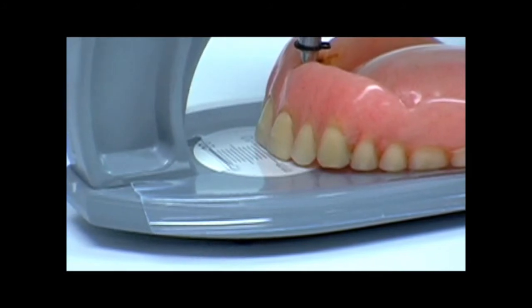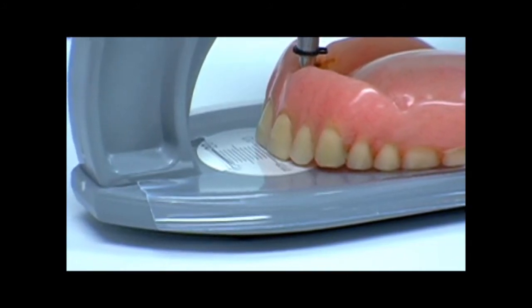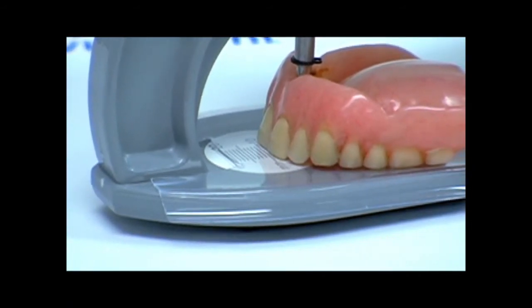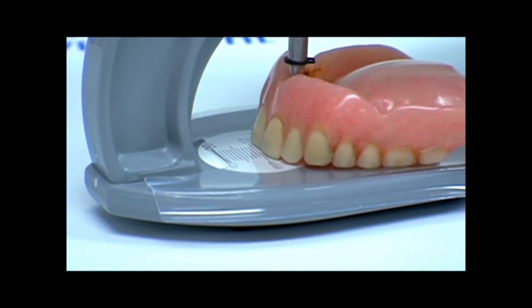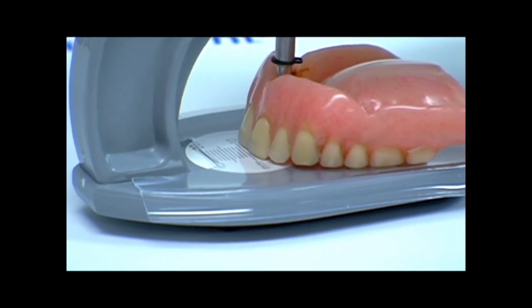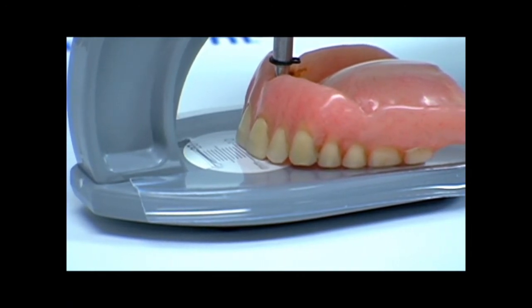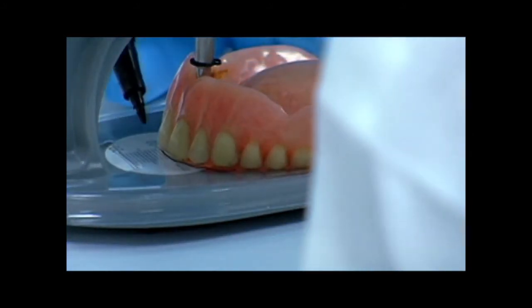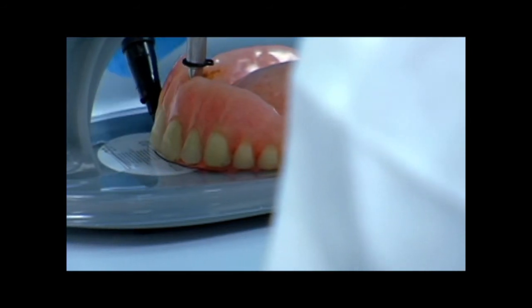And that's telling me how far forward the incisal edges of our teeth are. Now, again, I have the option to accept the 10 millimeters or to increase that by several millimeters, depending on my clinical evaluation of the patient's existing denture. Again, in Michael's case, there's no question I want to pull these forward, minimum of about 2 more millimeters, I think, to help give him a little bit more lip fullness. And another way of communicating this is by putting a marker here, and I can now mark the actual labial position of the patient's existing denture teeth.